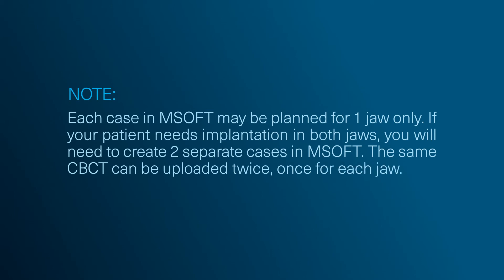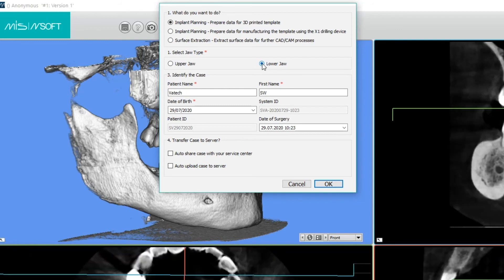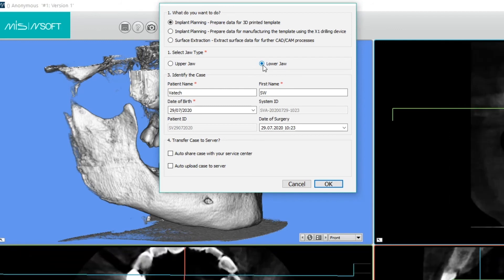In this case, we are planning in the lower jaw. Insert the patient's surname, first name, and their date of birth.